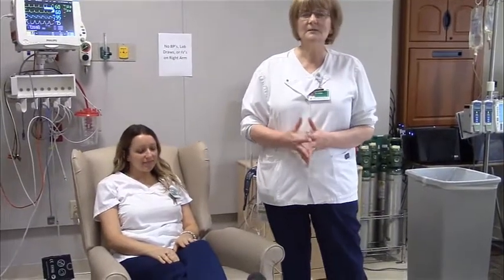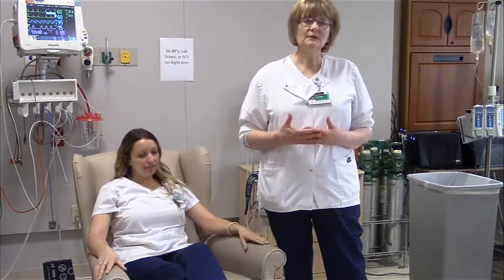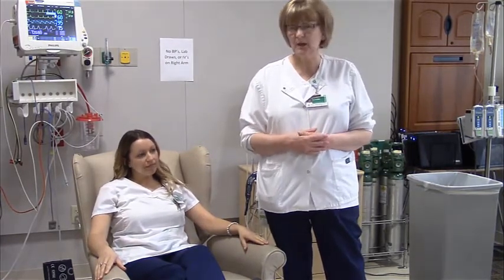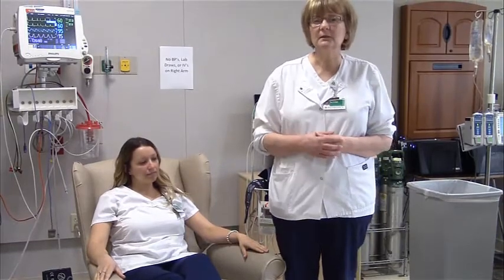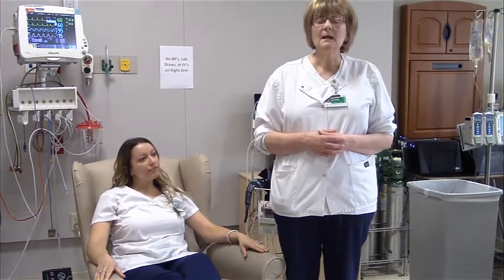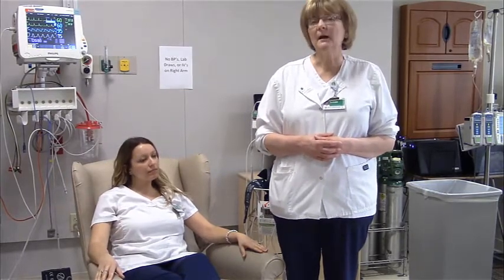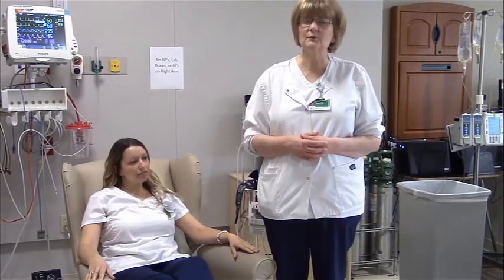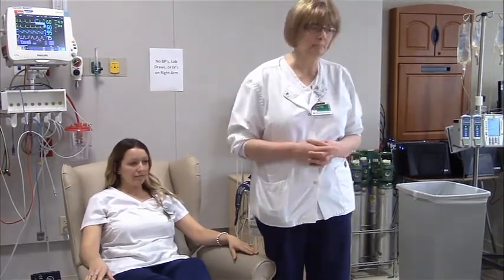Okay, now we're going to be taking a look at vital signs. I want you to get your nursing assistant unit packet out and try to find your reportable condition page, because it's going to be talking and showing you about your normal and abnormal findings related to vital signs. Listed there at the top of that page is for the adult population. At the bottom of the page is for the pediatric population. It's your reference tool to know whether or not you should be alerting your nurse to an abnormality.